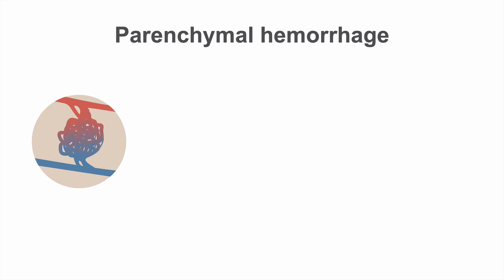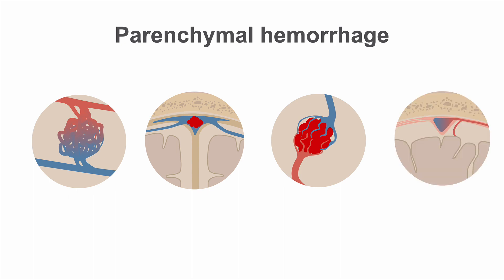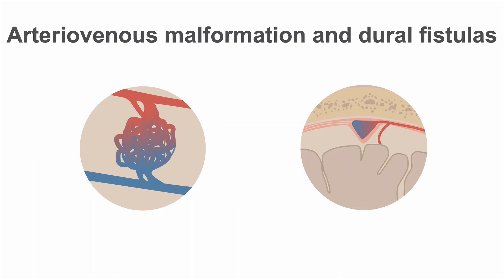In patients who present with parenchymal hemorrhage without subarachnoid hemorrhage, you should first consider the possibility of an underlying arteriovenous malformation, venous occlusion, cavernoma, or dural fistula. The enlarged blood vessels that supply an arteriovenous malformation or dural fistula, because they are usually on the surface of the brain, can be mistaken for subarachnoid blood on non-contrast CT.